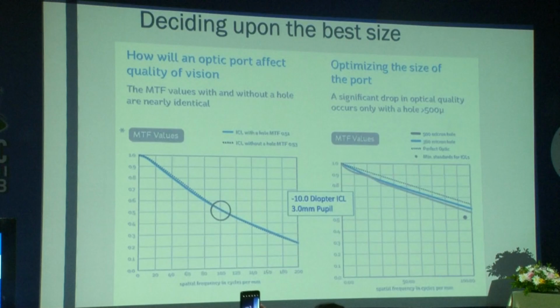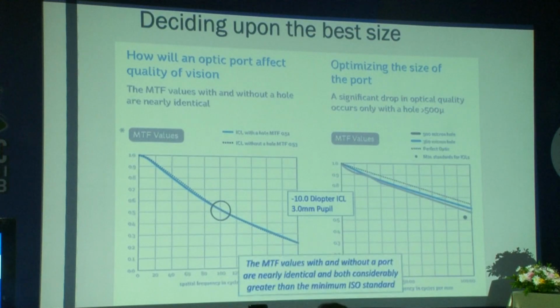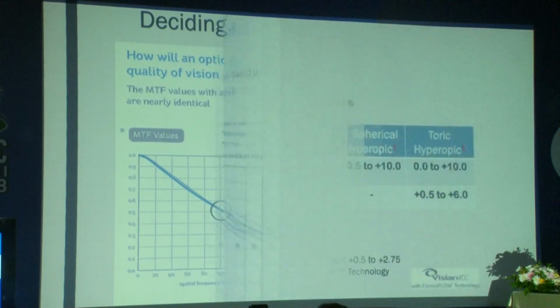So the current size of port, the results have shown that the optical quality, if you compare it, the modulation transfer function versus a regular V4B ICL is unchanged. And the results for quality are more or less comparable.